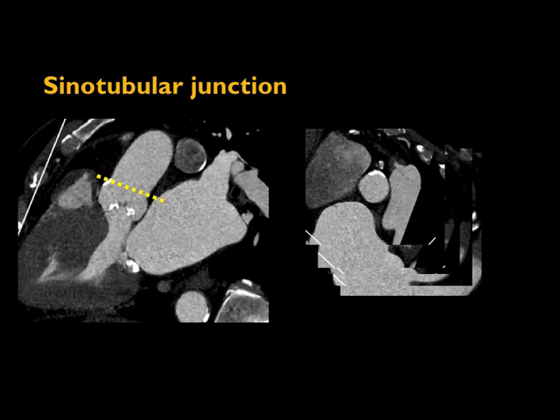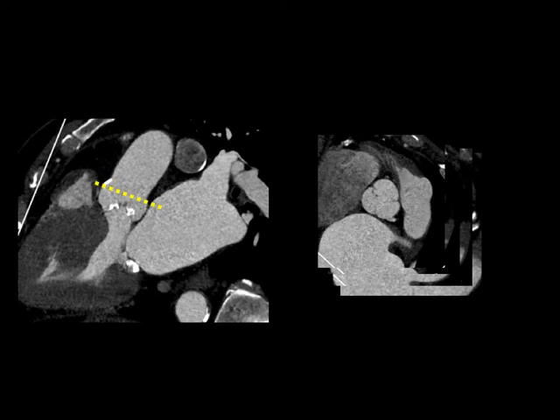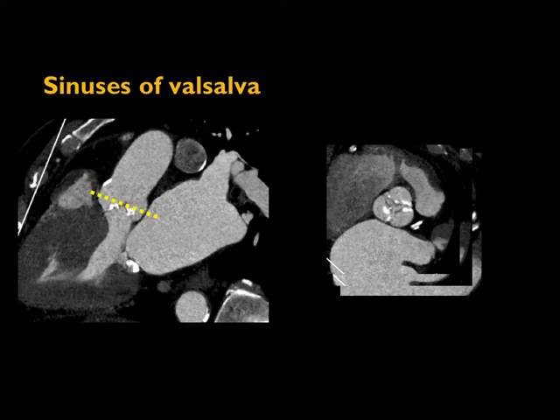Here's a stack of images through this region from short-axis plane reformats to give a sense of the anatomy. Starting high at the sinotubular junction, you get a nice round appearance above the right coronary artery origin. Stepping forward into the sinuses, you see the left coronary artery origin posteriorly at about the five o'clock position. A little lower, we're at the midpoint of the sinuses of Valsalva where the sinuses are at their largest.